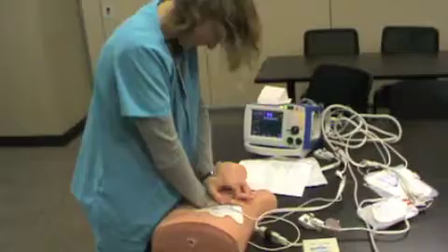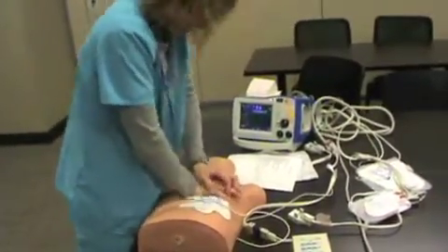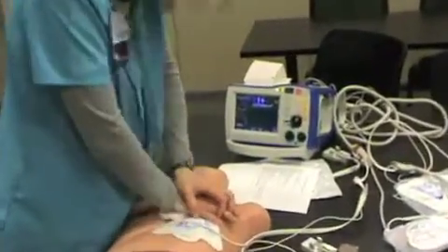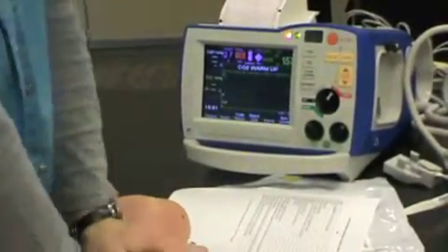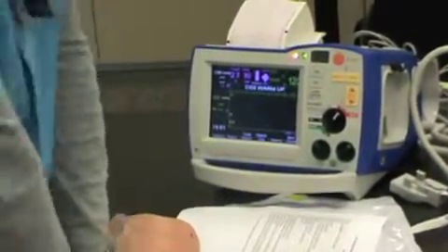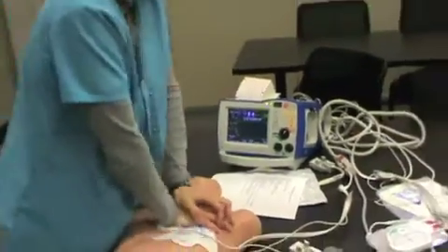Push harder. I wasn't pushing hard enough, so it reminds me to push harder. Compressions. And it tells me I'm doing a good job. Or if I slow down too much, I get a reminder metronome. It tells me to speed up. As long as it's quiet, I'm doing a good job.